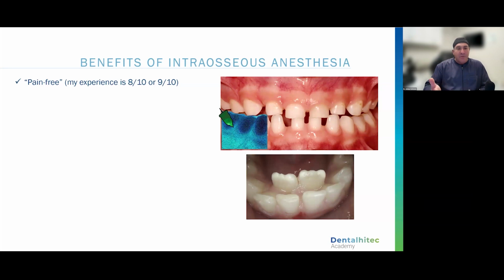For example, I was talking to a doctor last night and she was saying that sometimes, after step 1 and her manual bone penetration, and after maybe a third of the carpule that she's given, the patient will react. Well, what the patient's feeling there is just pressure.